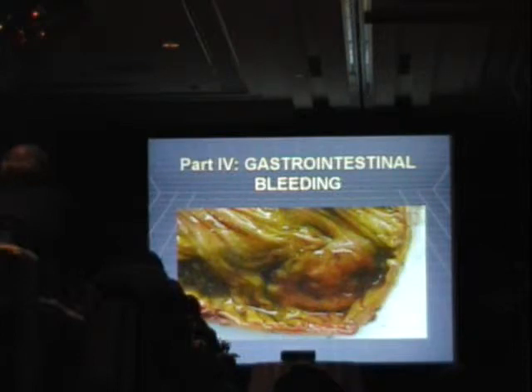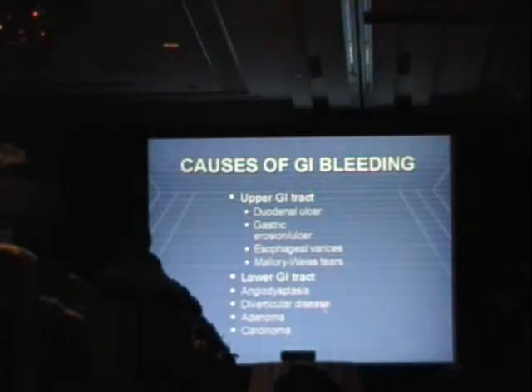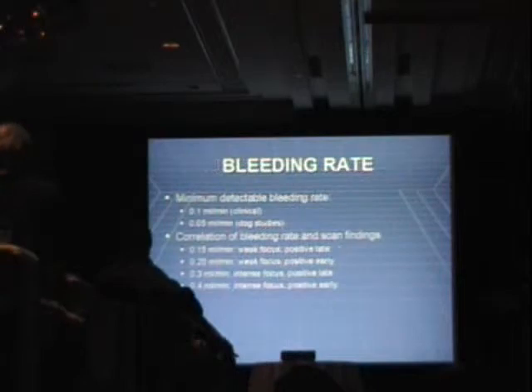This is another fairly common indication. This is a patient with a tumor. It's bleeding from the tumor, a carcinoid in the bowel. Causes of GI bleeding are very manifold. We don't really have to evaluate what the cause is. We're just looking at the site.